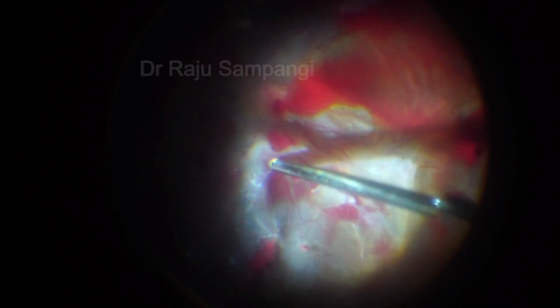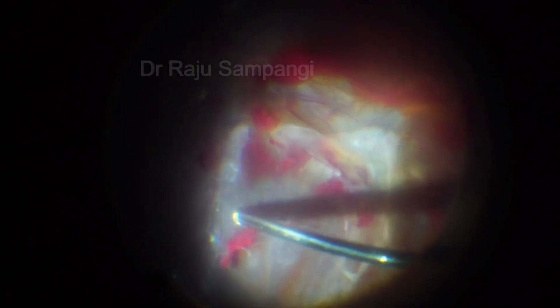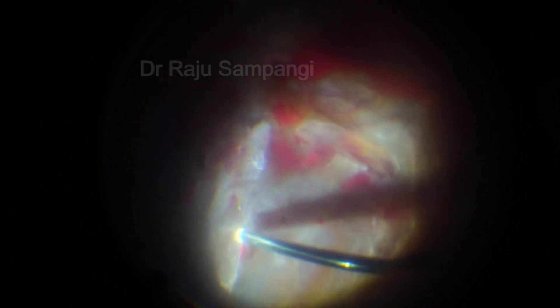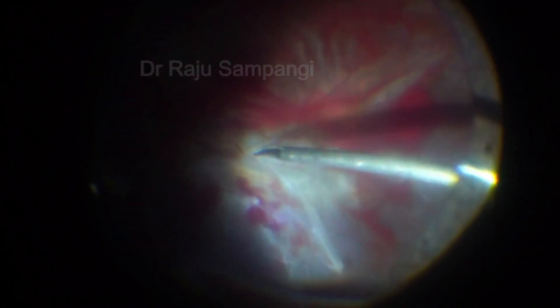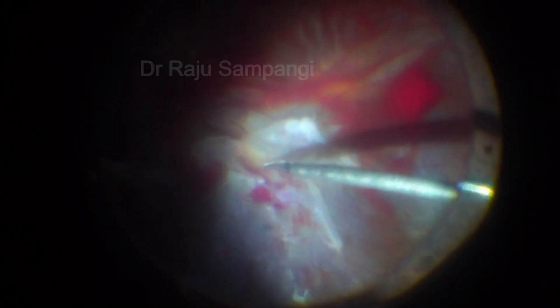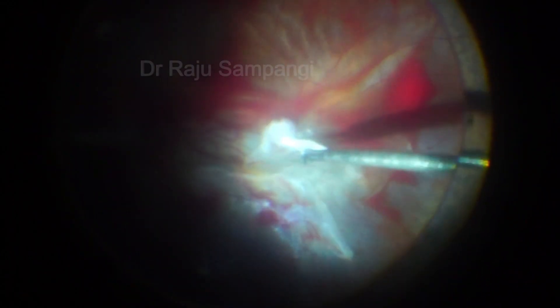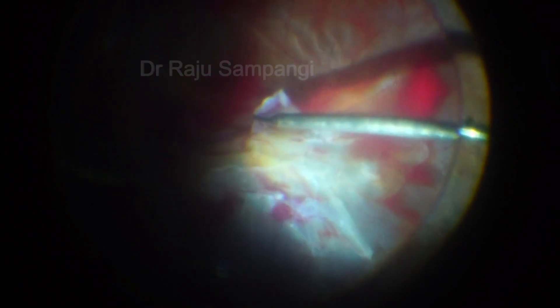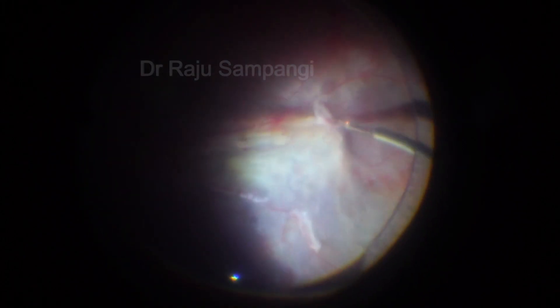Proliferative membranes in the superior quadrant were segmented and removed carefully with the cutter. Denser adhesions along the superior arcade were segmented with scissors. Secondary membranes were extending over a wide area; they were identified and peeled to release the traction.